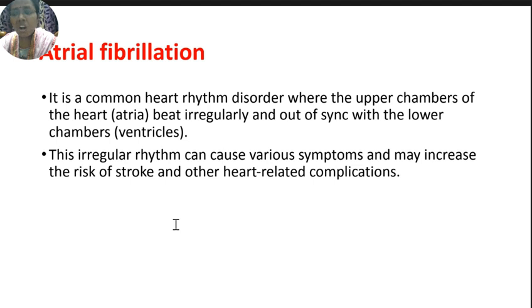Then the tall QRS complex. The tall QRS complex may indicate left or right ventricular hypertrophy. It means the heart muscles are enlarged. Due to the enlargement of the heart muscle, it indicates right ventricular hypertrophy. So this may widen the QRS complex. Okay. Abnormal Q waves: abnormal Q waves may be signs of myocardial infarction.